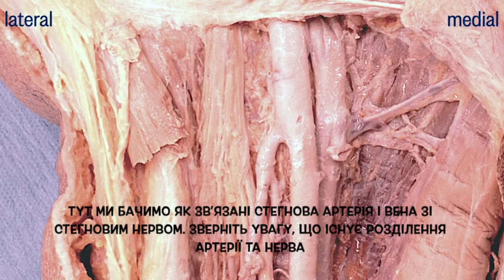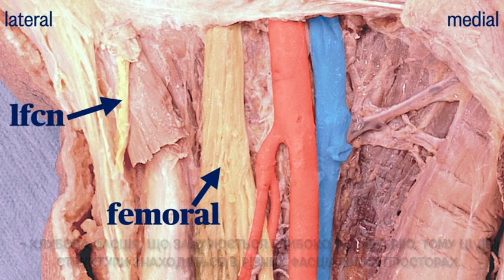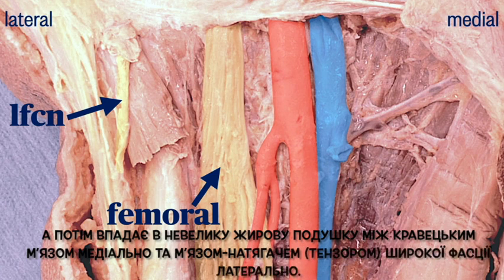Here we see the relationship of the femoral artery and vein to the femoral nerve. Note that there is a separation between the artery and the nerve. The fascia iliaca dives deep under the artery, so these two structures are in different fascial compartments. We see the LFCN in a more superficial fascial plane, running across the sartorius before falling into a small fat pad between the sartorius medially and tensor fascia lata laterally.